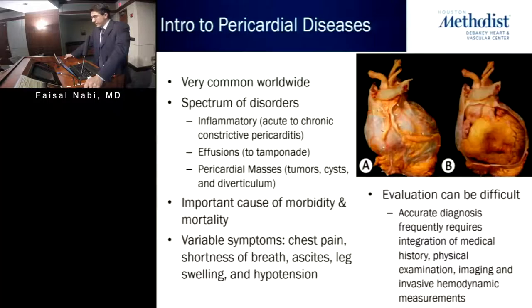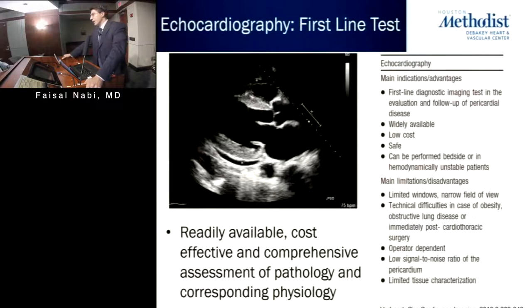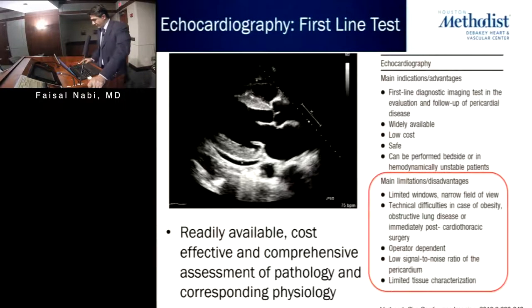And those of you who have treated these conditions know that sometimes it can be very difficult to evaluate. An accurate diagnosis frequently requires a combination of a physical examination, a medical history, good imaging, and frequently, in addition, invasive hemodynamic measurements. When it comes to non-invasive evaluation, echocardiogram is the first line test, and there are many very good reasons for this. It provides a tremendous view of anatomy and the corresponding physiology that goes along with it. But of course, there are limitations to this technique, which many of y'all know, including limited windows to see the heart. It can be difficult in certain groups of patients and does not have any ability for tissue characterization.